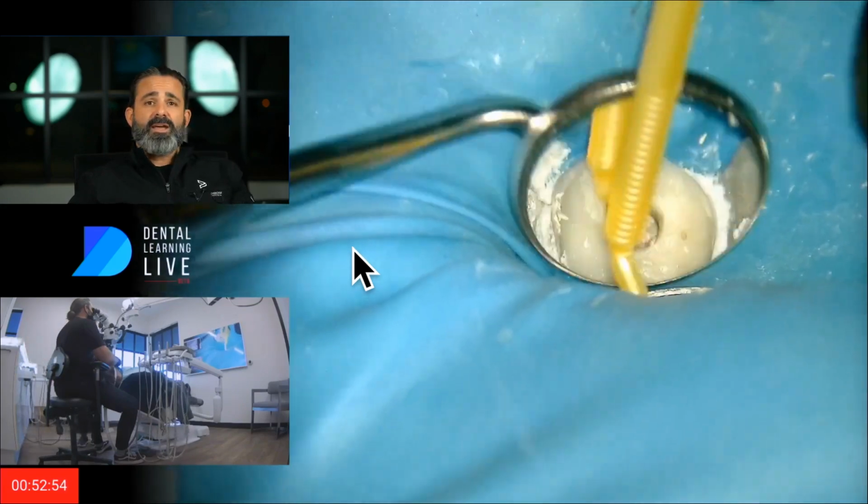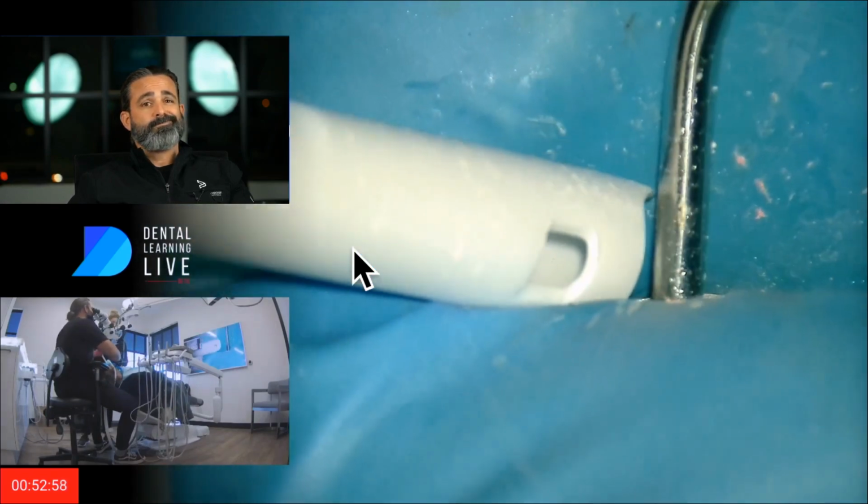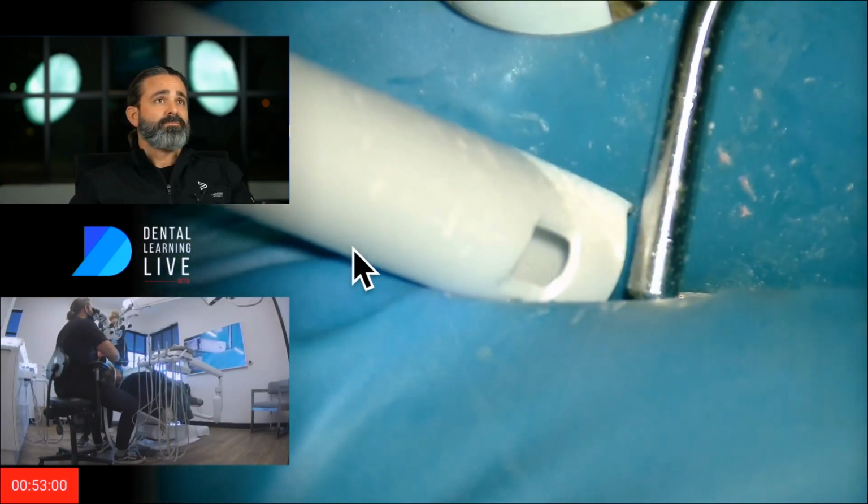Now, after I've done that, I'm going to clean that up with alcohol. Water, rinse, dry.